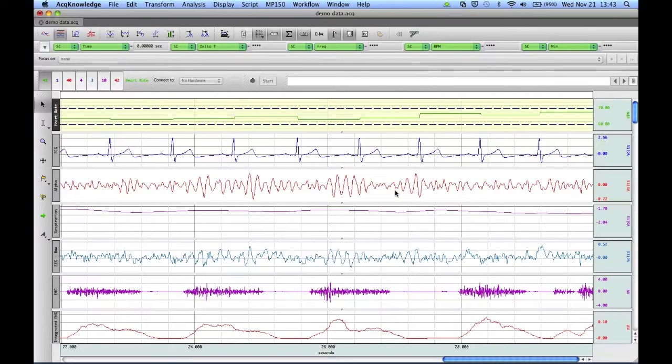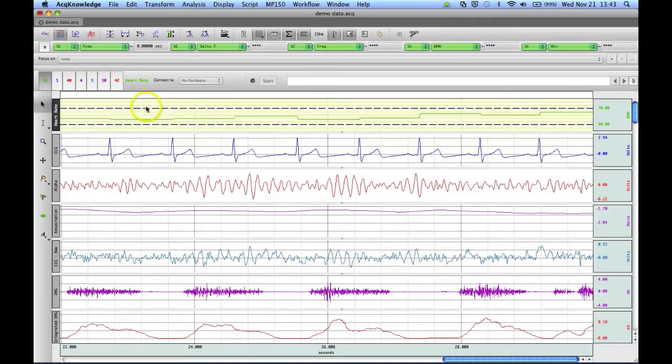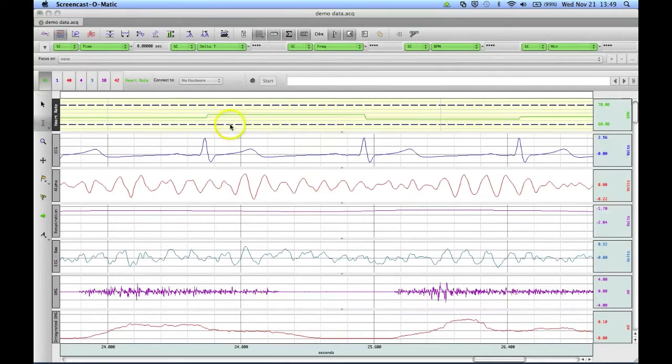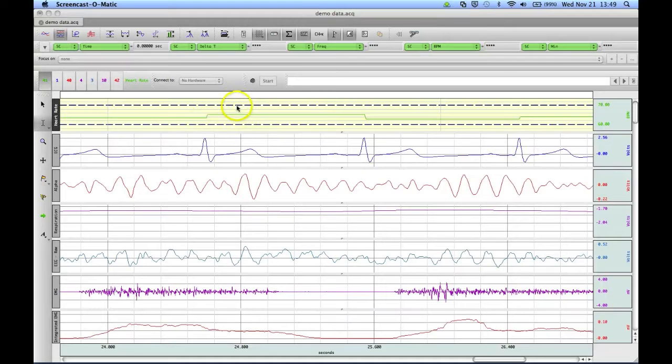And now what you'll see is that we have the heart rate channel with dashed lines at 70 and 60 BPM. And what this does is it allows us to see easily if our heart rate is going below 60 or above 70 beats per minute.